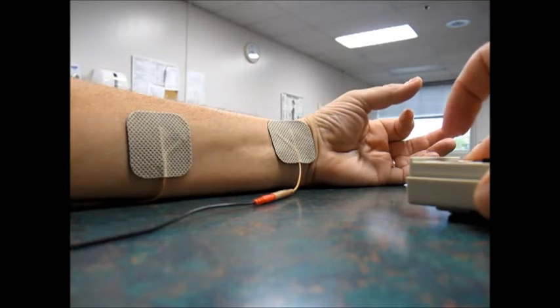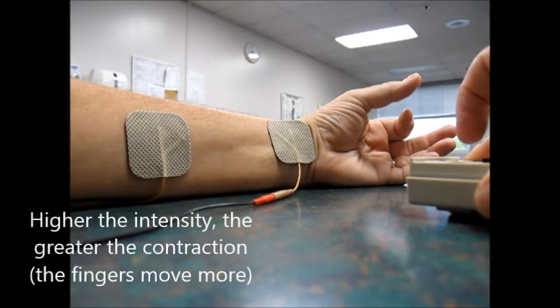The higher the intensity, the more the contraction. You can see the pulsing of the thumb.